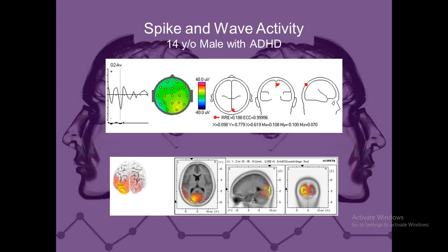These have been considered questionable patterns. If you send it to a neurologist, they will not call it because it is a disputed pattern. But electroencephalographers, they're supposed to call these because they let us rule out whether it's something that has significance or not, based upon what we have found in the patient themselves.